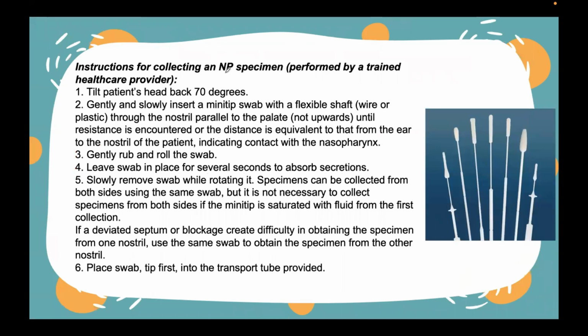So here is the instruction in collecting your nasopharyngeal. Pagka po nasopharyngeal, mas manipis yung shaft. Pagpansin ninyo, sa oropharyngeal, medyo mas makapal-kapal. Okay? So ito po yung sinasabi ni ma'am na indicator kung hanggang saan lang yung lalim. Merong parang marka dyan. Okay? So basahin lang natin yung pinaka-step-by-step procedure.